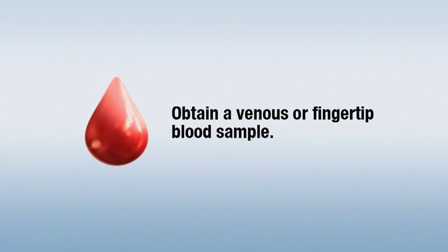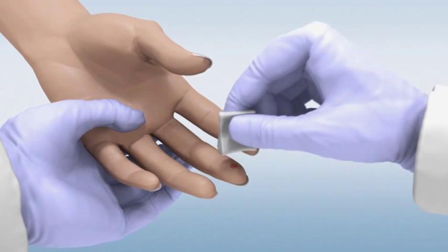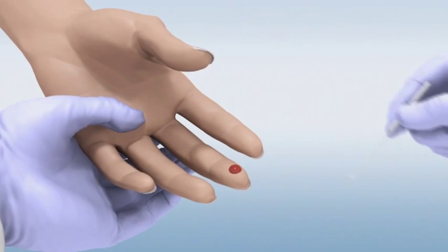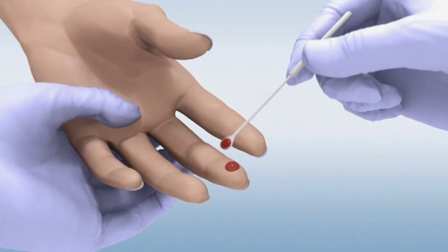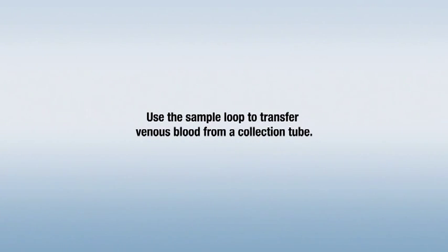Obtain a venous or fingertip blood sample according to your normal laboratory practices. If you're taking a sample from a fingertip, wipe away the first drop of blood after pricking the finger and sample from the second drop. Touch the sample loop to the drop of blood, allowing the opening of the loop to completely fill with blood. Use the sample loop to transfer venous blood from a collection tube.